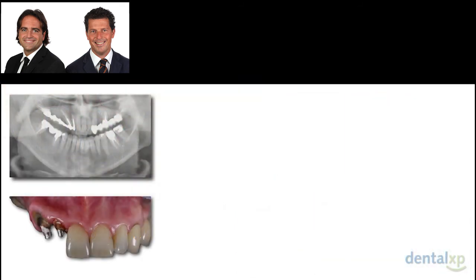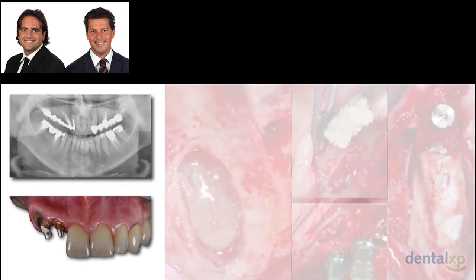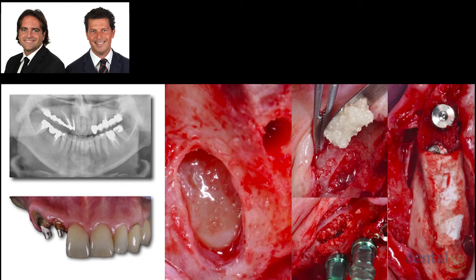The dental team immediately understood that treatment of an upper partially edentulous patient with a high aesthetic risk and poor posterior bone quality and quantity, combined with a prosthesis on implant and natural dentition in the same arch, entails considerable surgical and prosthetic difficulties to reach a final restoration that perfectly integrates into the final smile and the face of the patient.